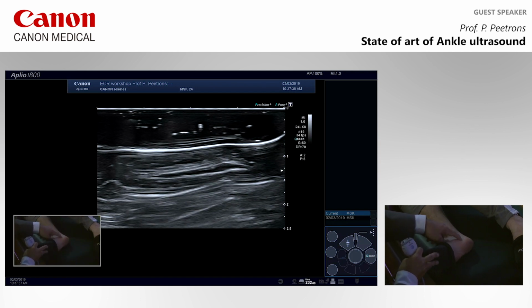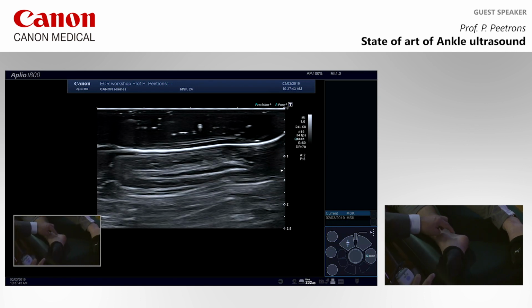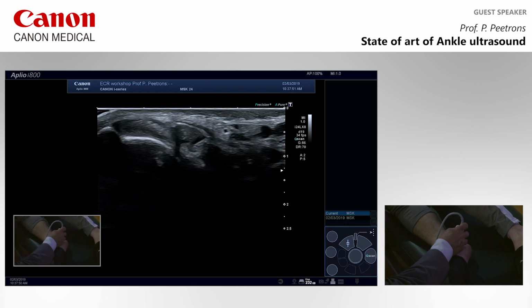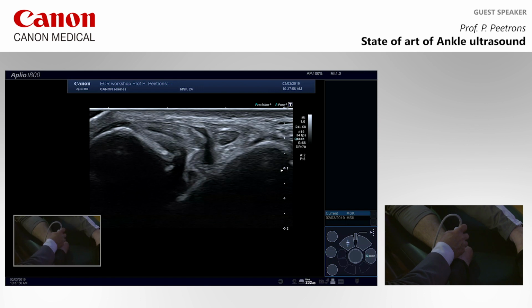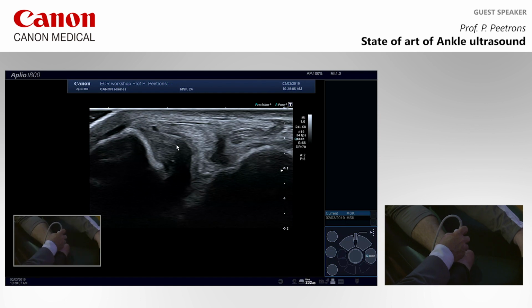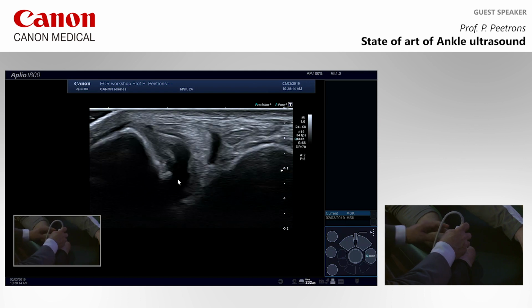Because the talus is here and the tibia is there, and if I close the gate, the two bones are close together. So I put my probe on the tibia, and I'm looking to the talus. Okay, so here is the tibia, here is the posterior tibial tendon, here is the talus, and you say, oh, he has a very big deltoid ligament lesion here, because this is normal, and then suddenly it goes completely black to the bottom of the image.